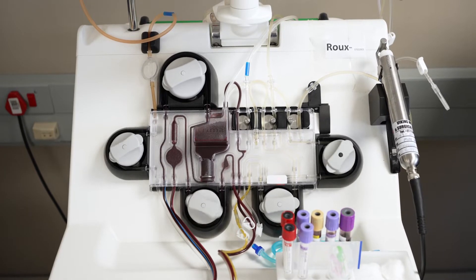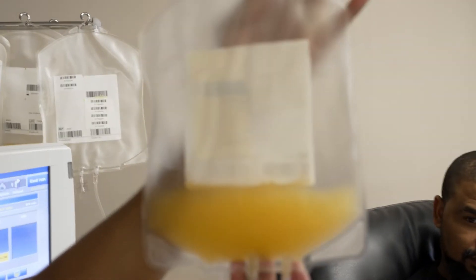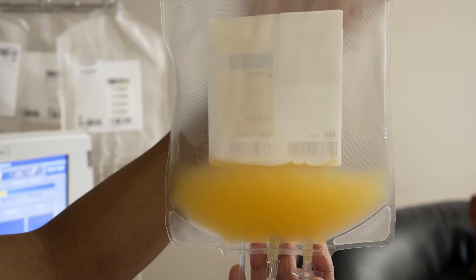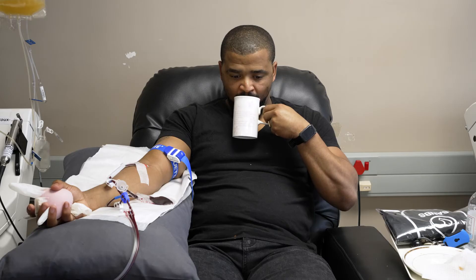The process is repeated continuously for about 90 minutes until we have collected enough white blood cells for the study. It's very important to mention that we don't do anything that could affect your blood or harm you during collection, and your body will make new white blood cells quickly after the procedure.